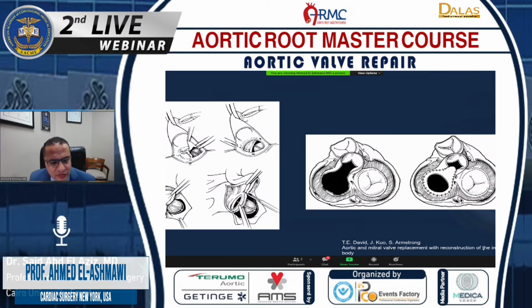Just to shed some light on the aortomitral curtain or the intervalvular fibrosa, and a reconstruction technique for that complex anatomical problem, which has been described by many surgeons. Dr. David presented a series of this at the AATS in 1997, and it's well known as the commando procedure. However, the proper term is reconstruction of the aortomitral curtain or the intervalvular fibrosa. This is just to simplify the video that I'm going to show you shortly.